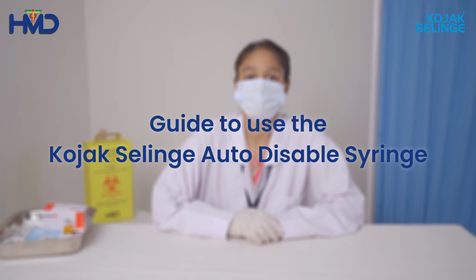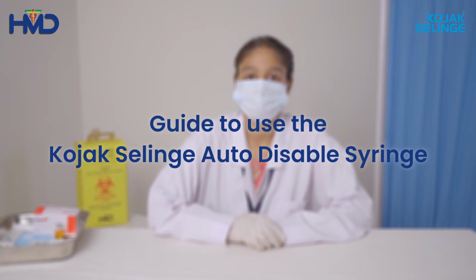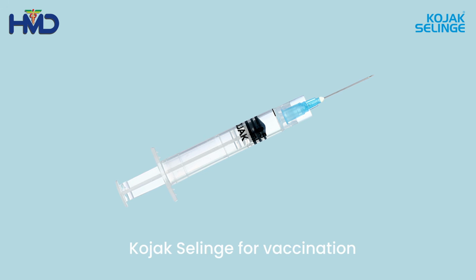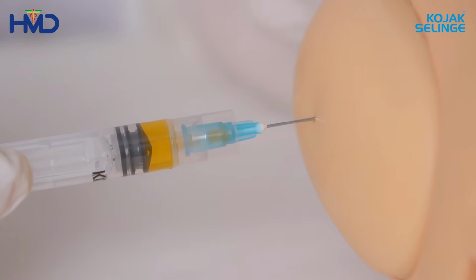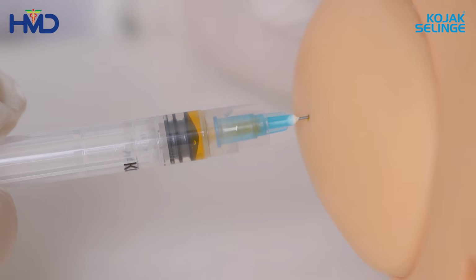Welcome to our comprehensive guide on using the Kojak Auto Disable Syringe. Let's first understand the difference between the regular disposable syringe and the Kojak Auto Disable Syringe. When you use disposable syringes, there is a chance of reuse. To mitigate the problem, we have a solution: the Kojak Auto Disable Syringe, which does not allow healthcare professionals to reuse the syringe.